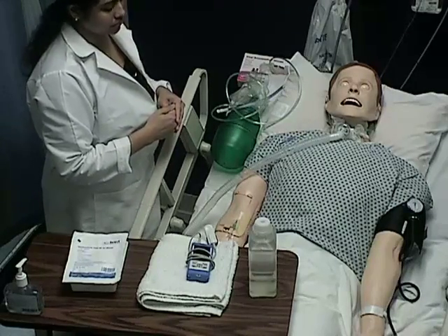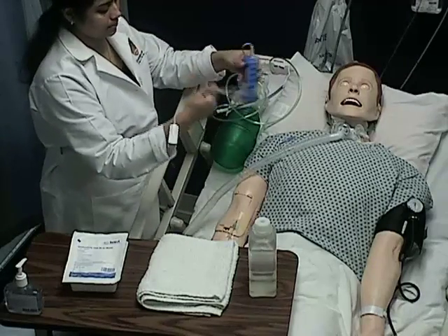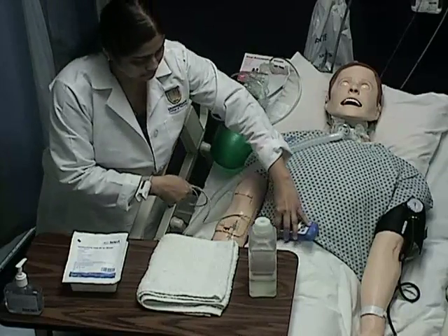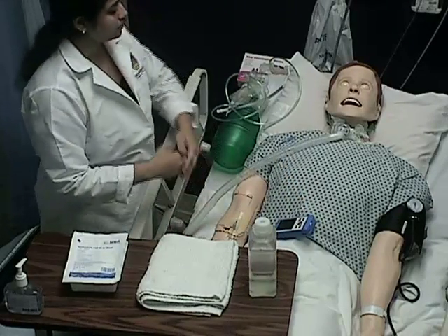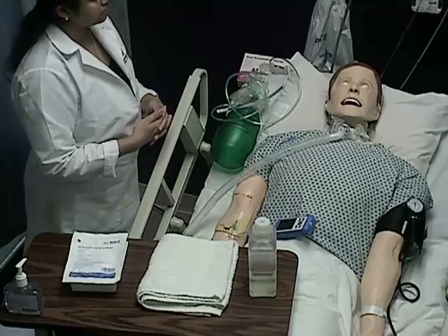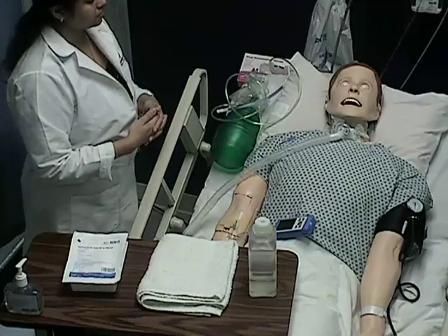Place pulse oximeter on patient. While doing so, assess the patient's knowledge of the procedure and answer any questions the patient may have. Step 2. Planning. Obtain assistance from available staff if necessary.